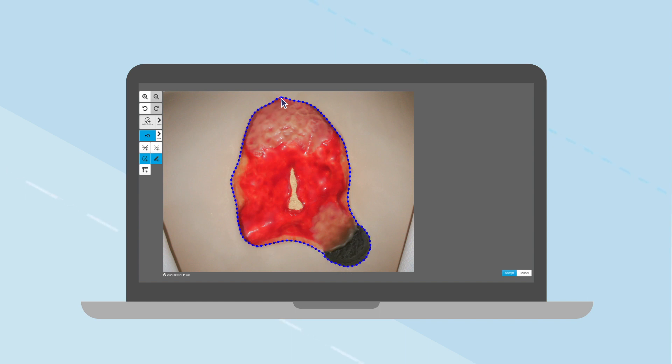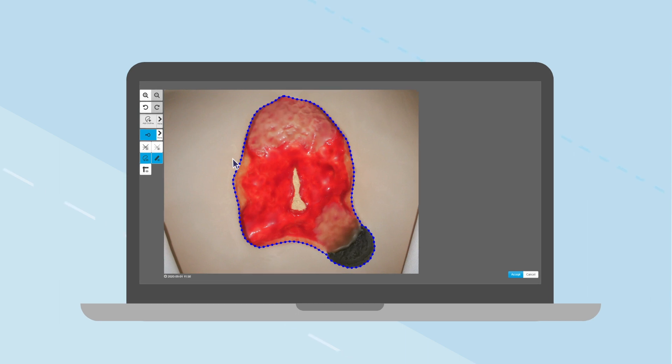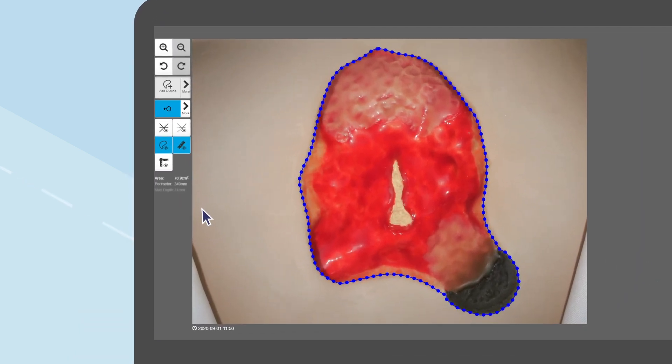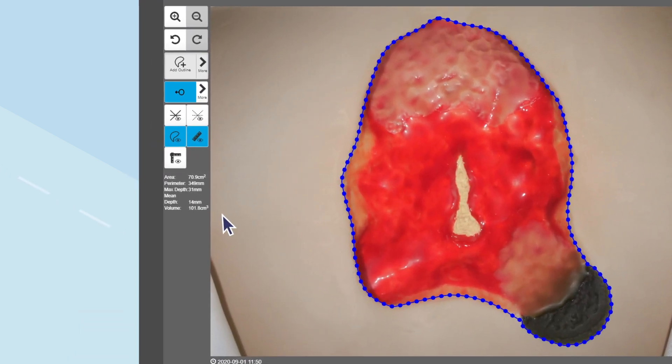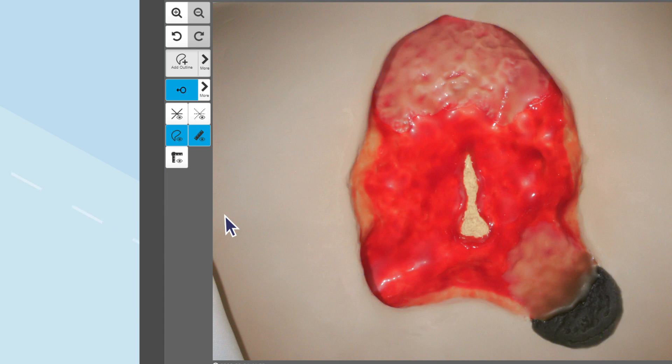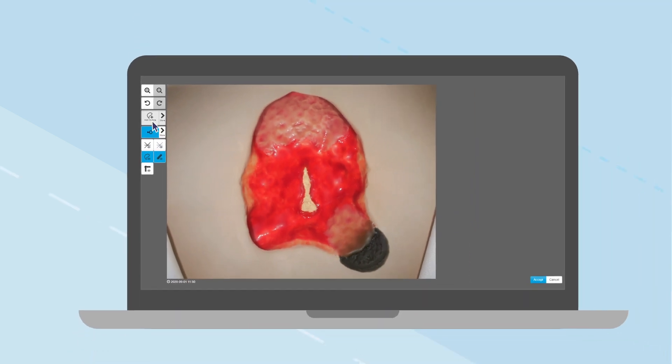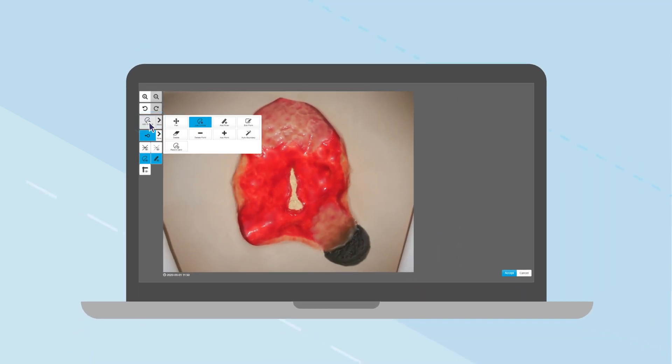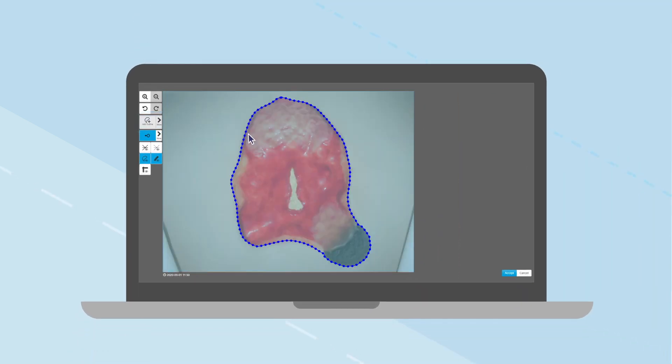Once completed, the area, perimeter, depth, and volume measurements appear on the screen. For quick assessments, this process can be automated using the Automatic Boundary Detection tool.